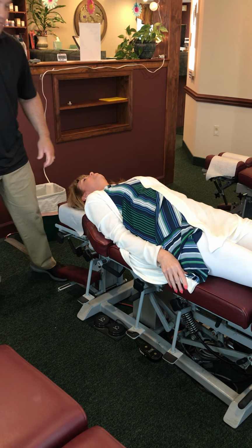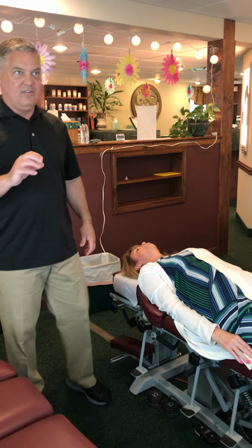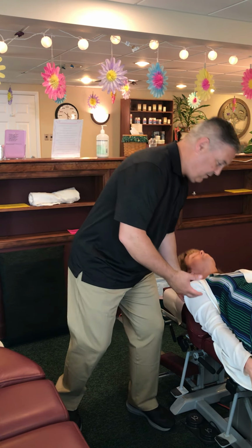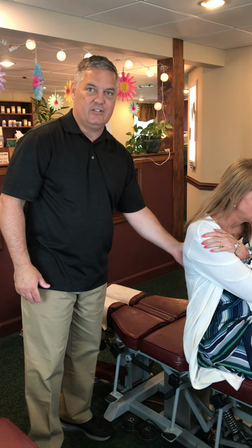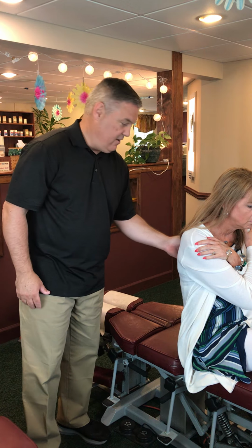Okay, from a perspective of thoracics, two basic ways from a manual perspective that we take them. One, we do anteriors. Okay, so sometimes I'll do a seated anterior. So Cheryl, let's have you sit up for me. Seated anterior. Sometimes people just move better, especially lower thoracics. It's just a fun technique I like to use.